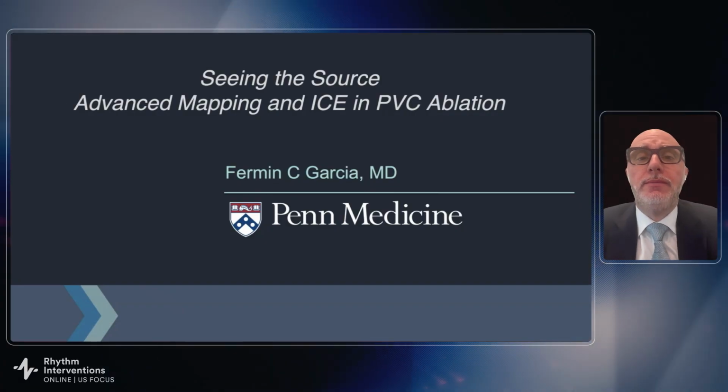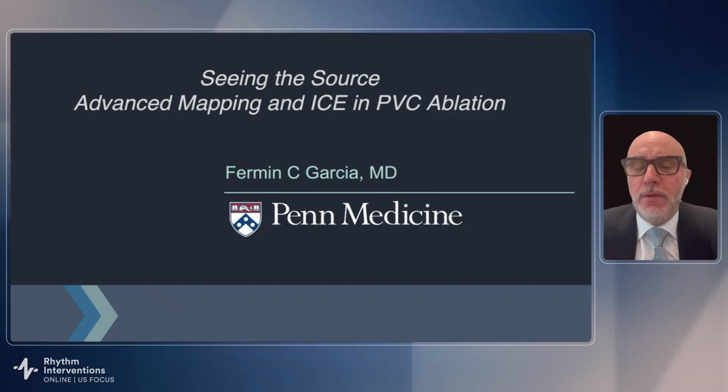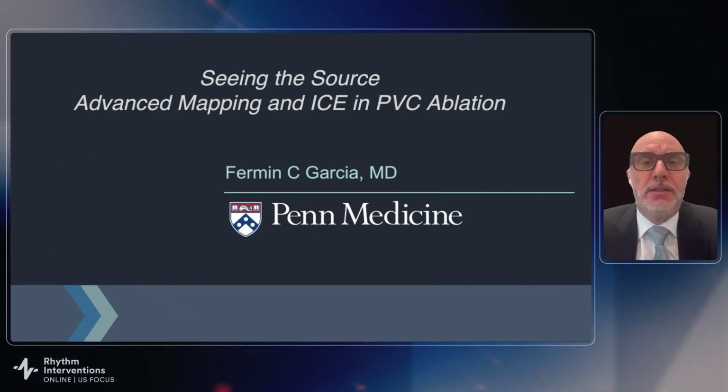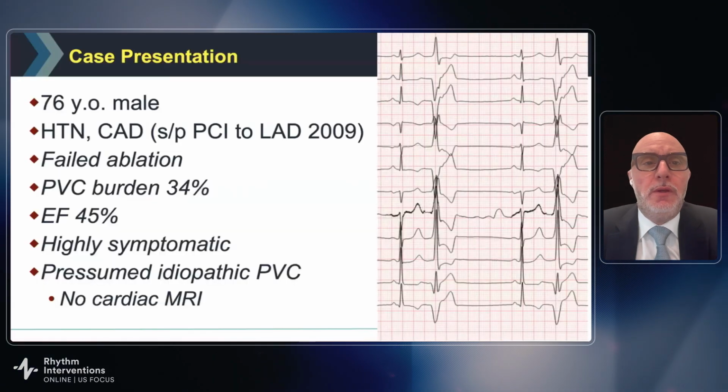Good afternoon. Thank you, Devi, for the introduction. I'm going to discuss the title of my presentation, Seeing the Source, Advanced Mapping and Intracardiac Echo in PVC Ablation.